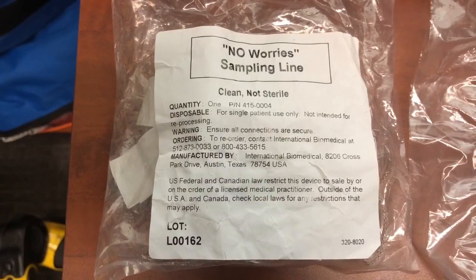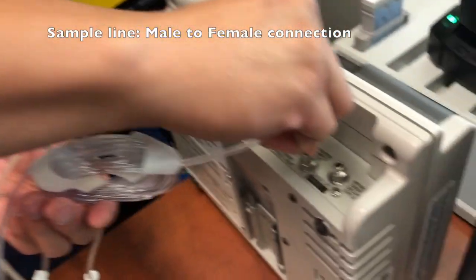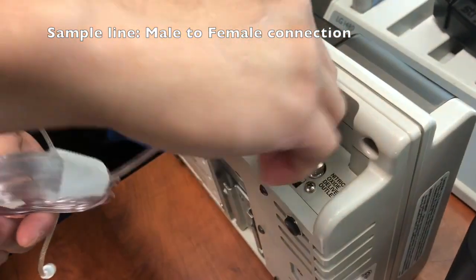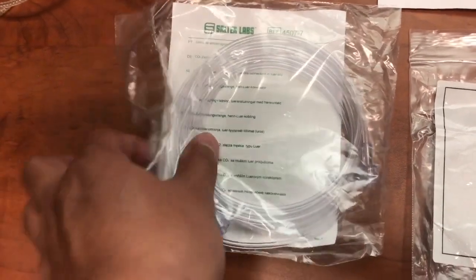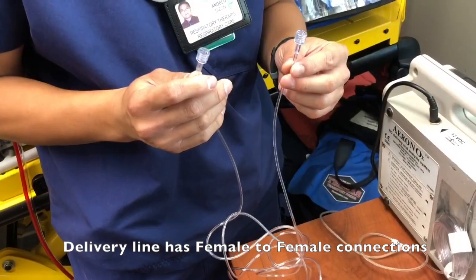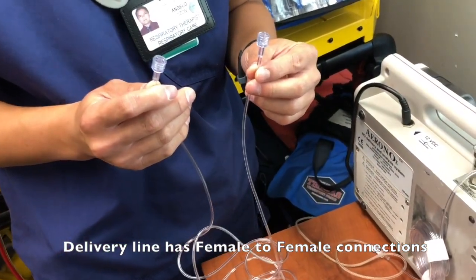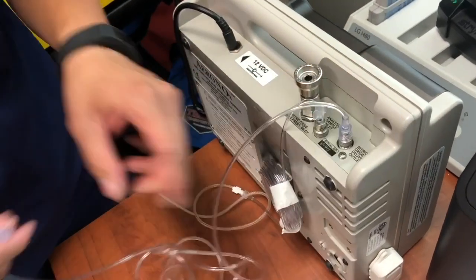The first thing you need is your sampling line. Take your sampling line and plug it in. Next is our delivery line — take your delivery line. It's female to female; that's the difference.